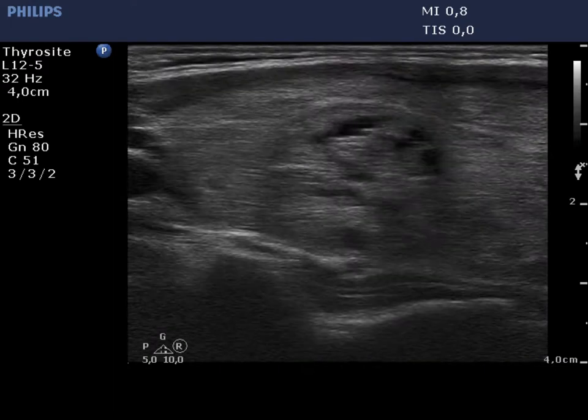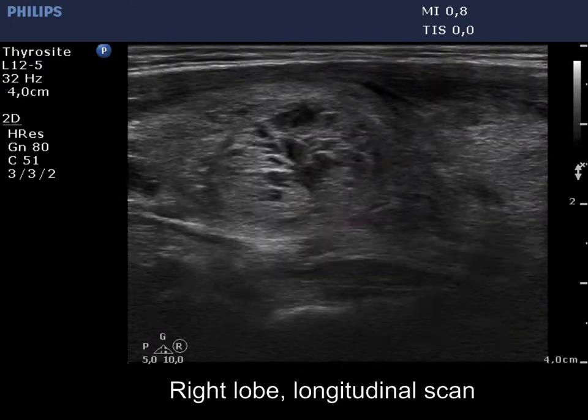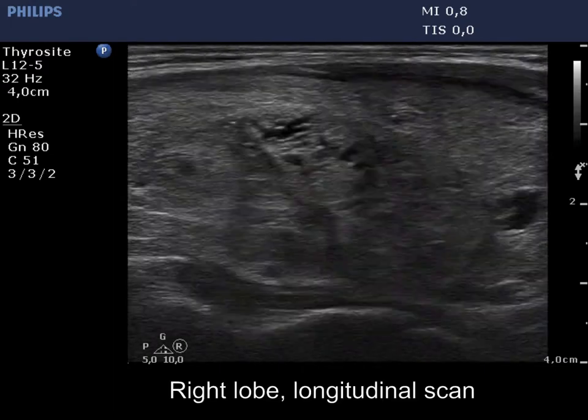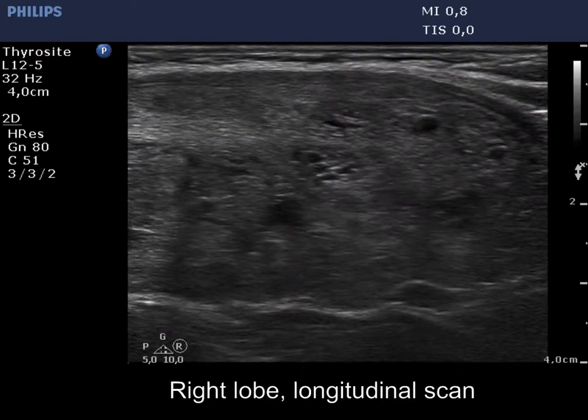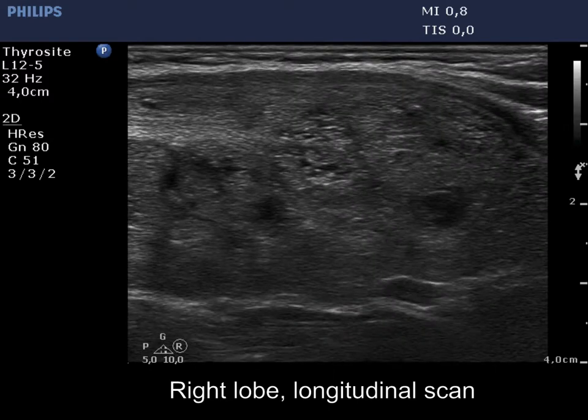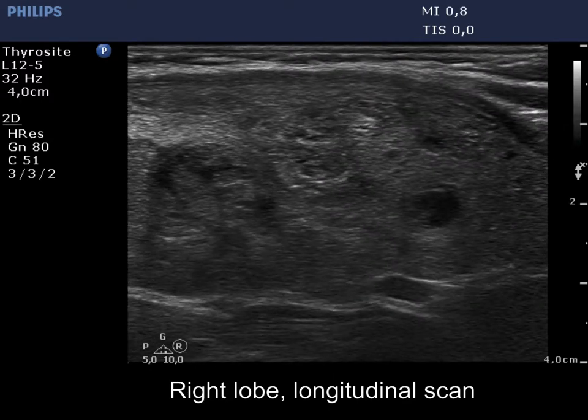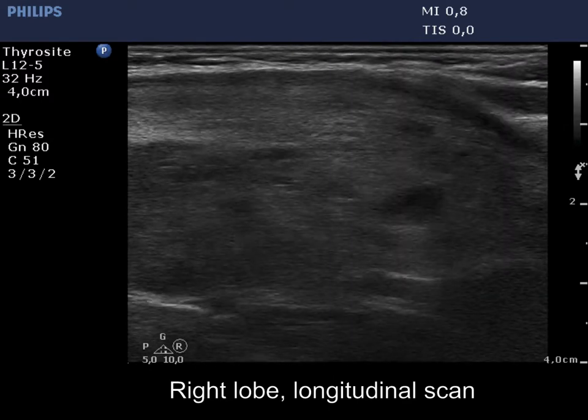Now, the longitudinal view is presented. It is worth paying attention to the lower pole of the lobe, on the right in the video.